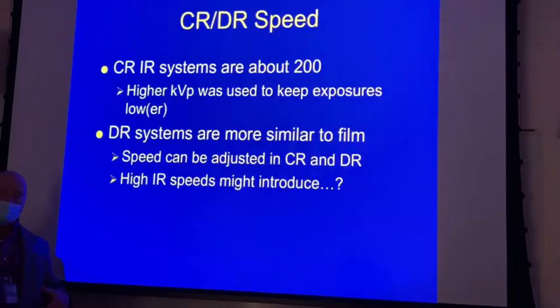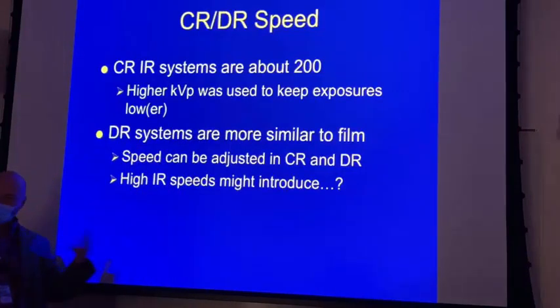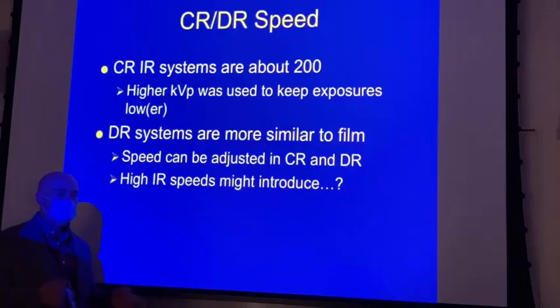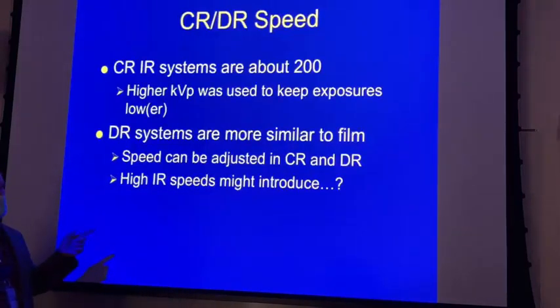So our repeat rate should go down, so overall the chances for a decrease in radiation dose existed. But the initial dose jumped by a factor of 2, okay? So very important distinction to make there. So what they did is that since kVp doesn't really affect contrast the way it used to with screens and films, instead of increasing our mAs, which would effectively double the patient dose, what we did was increase kVp, okay?